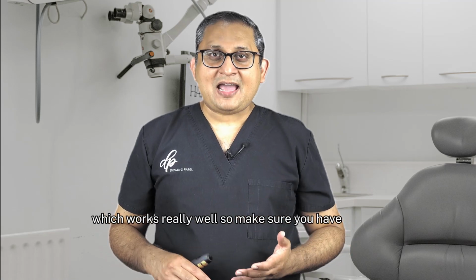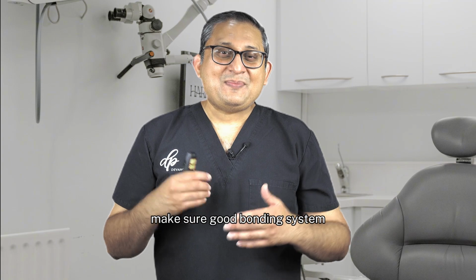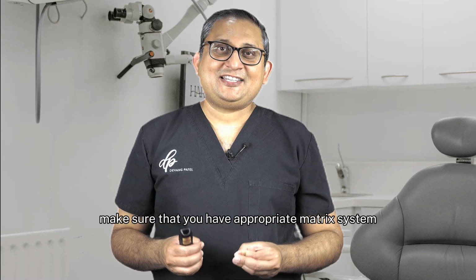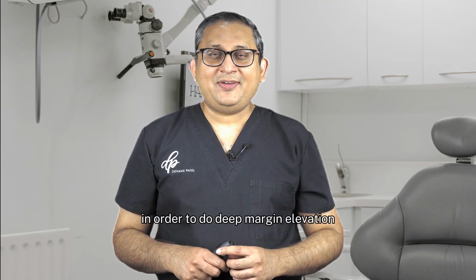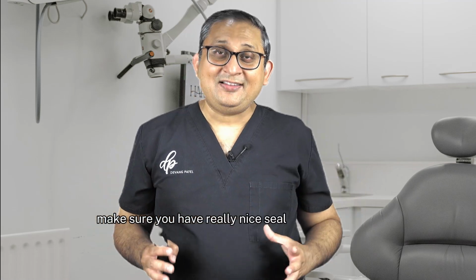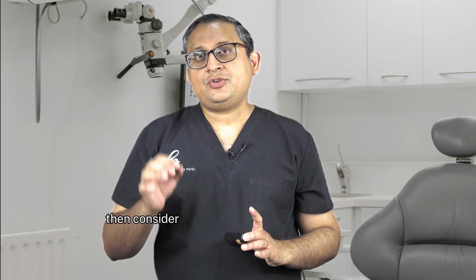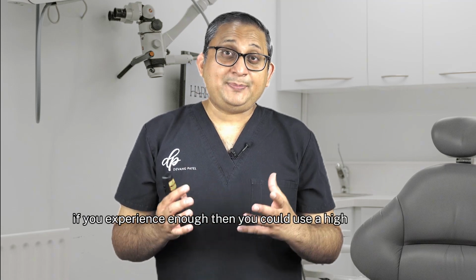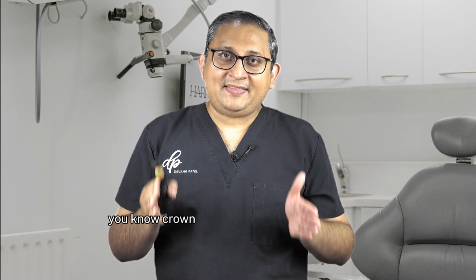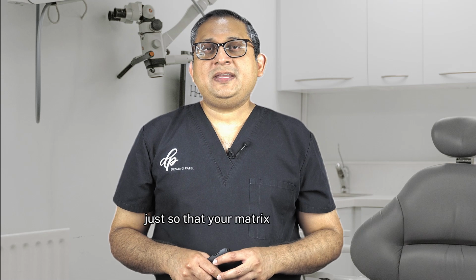So make sure you have enamel, make sure you have a good bonding system, make sure that you have appropriate matrix system in order to do deep margin elevation. When you are using matrix system, make sure you have really nice seal around the tooth. And if you can't get the seal, then consider doing a little bit crown lengthening. If you're experienced enough, then you could use a high-speed burr in order to create a little bit of crown lengthening interproximally, just so that your matrix band seats.